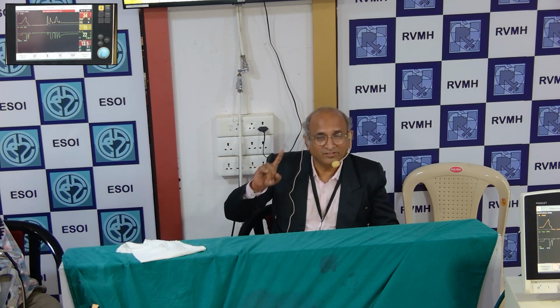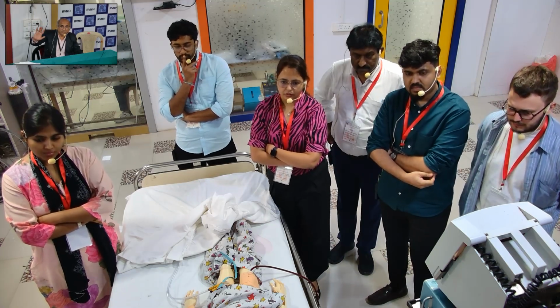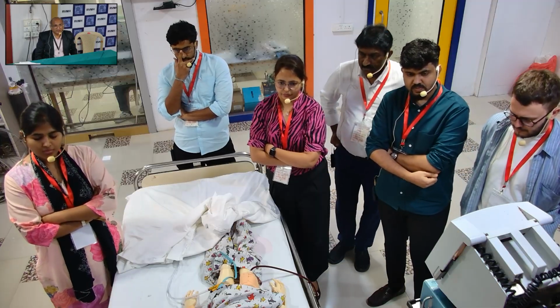Okay. So those patients who are ECMO dependent, you have to be mindful about that. One more thing you should have done is, the moment you see that the ECMO flow has gone down and P1 has become more negative, you try to go up on the ventilator. See, when I showed you in lecture very clearly, if there's something wrong with an ECMO, go up on the ventilator. You did it, I don't say you didn't, but you did it second. The first thing you should have done is go up on the ventilator settings immediately rather than going on the ECMO setting, because it's likely that there's something wrong with the ECMO. So you should have gone up on the ventilator.